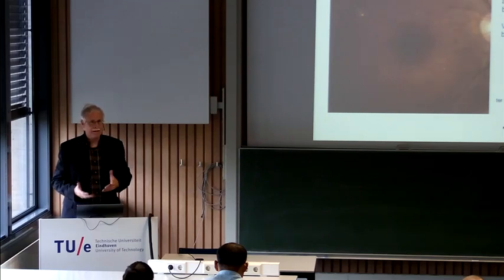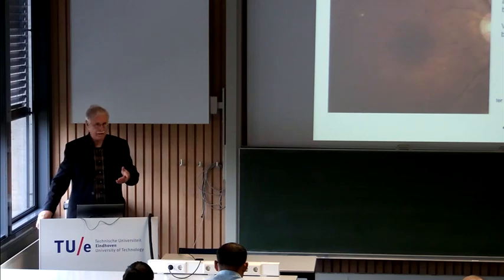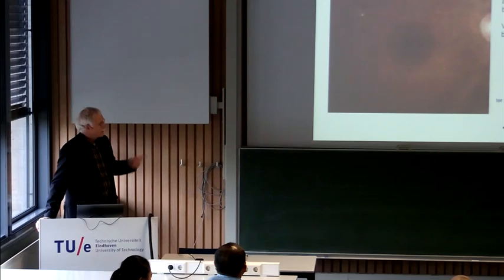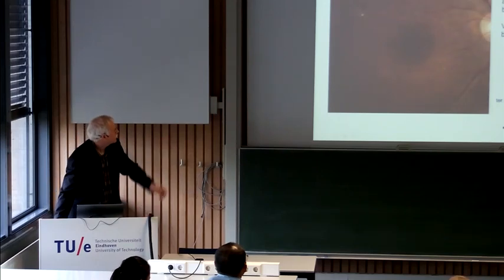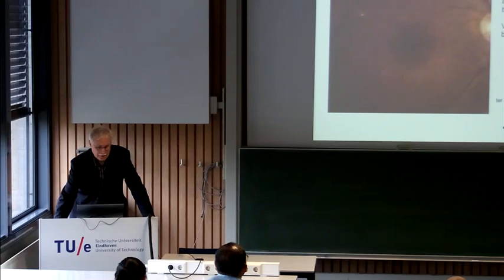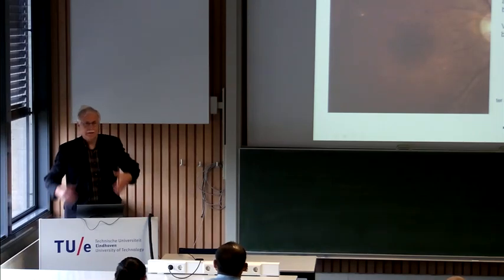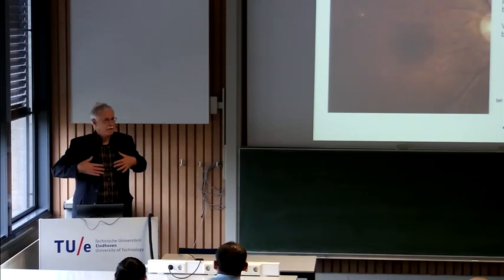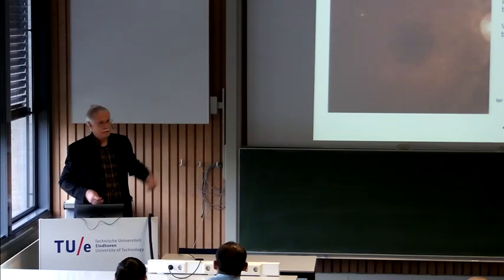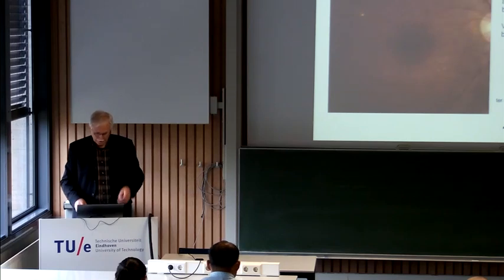That's called a filling-in technique, and in computer vision it's called in-painting. And you see the results of in-painting here. If you remove the vessels, it's much easier, and unfortunately the screen is not so contrast-rich, but you see a microaneurysm here. It's far easier detected without the blood vessels than with the blood vessels. So if you can remove them, doctors do this. They have a chest X-ray image and say, well, think away the ribs and then look for the tumors. That thinking away you do in your brain. It's actually a little bit the same as this. So this filling in is quite an important thing in in-painting.